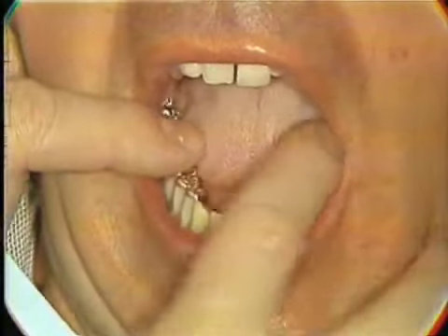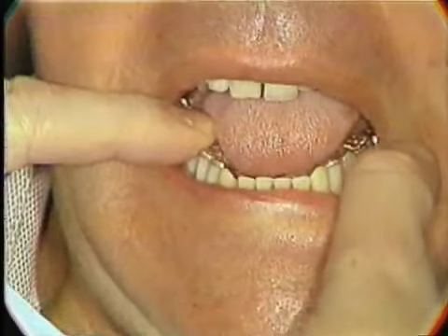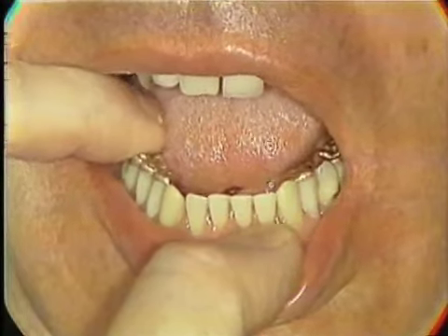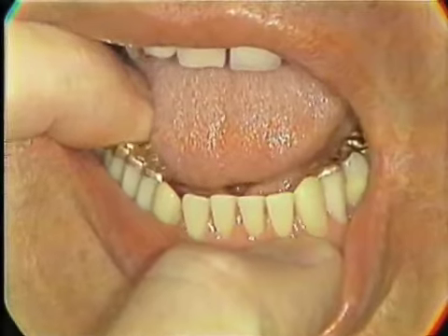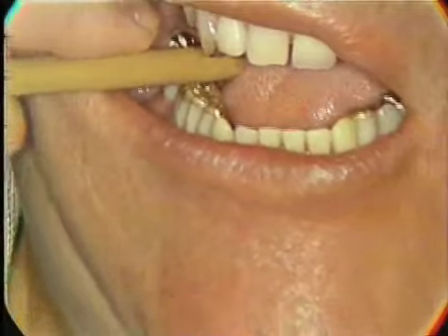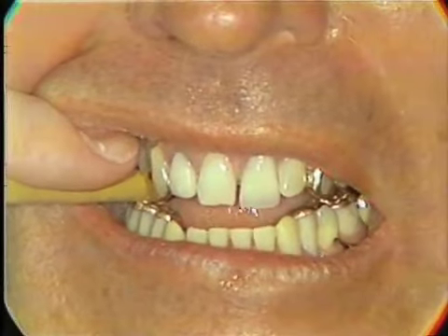With the base in the mouth, if it's a stable base, we should be able to apply a force on this side of the mouth and the other side stays stable. If we apply a force on this side and we have a movement of this base towards the bone because of a lack of detail or a compression or distortion of the tissue, then the opposite side will raise up. So if we put something between the teeth, have the patient apply a force, we can observe the opposite side of the mouth to see if we've got any movement.